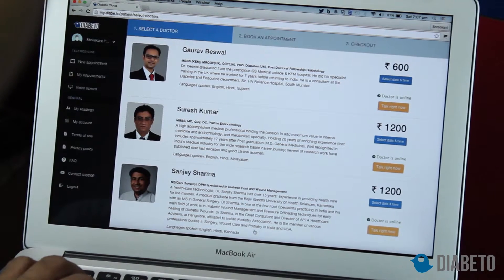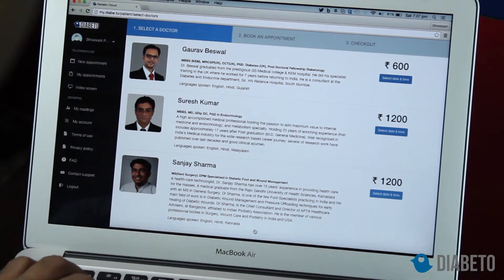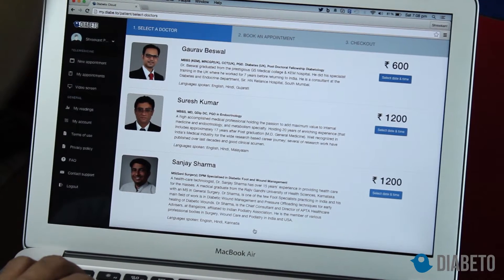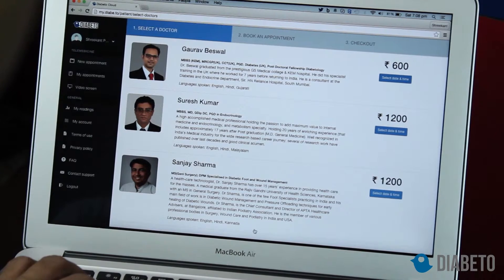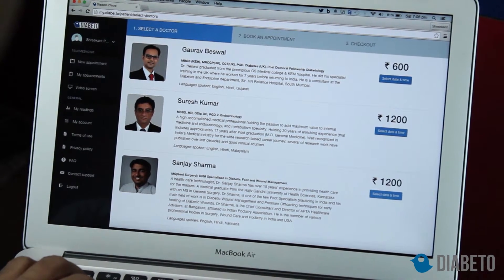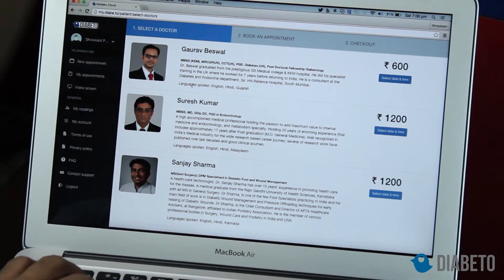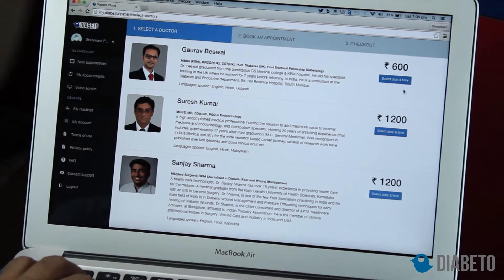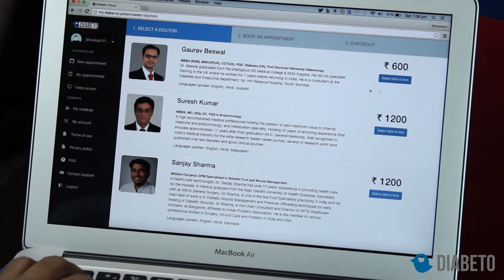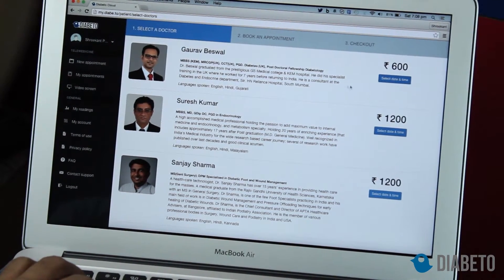The first screen I see is the panel of all the doctors — these are all the endocrinologists on our panel right now. If I want to take a new teleconsultation appointment, I can select one of the doctors. Let's try and take a teleconsultation from Dr. Gaurav Beswal.